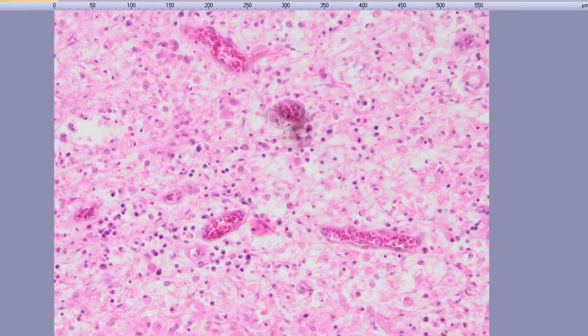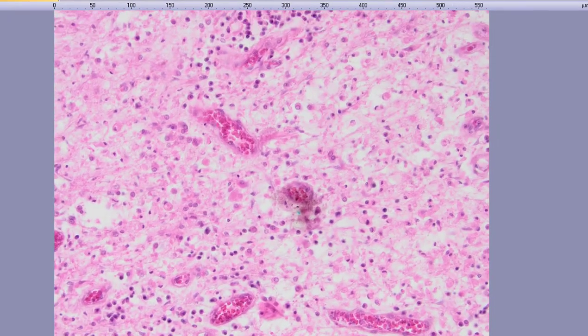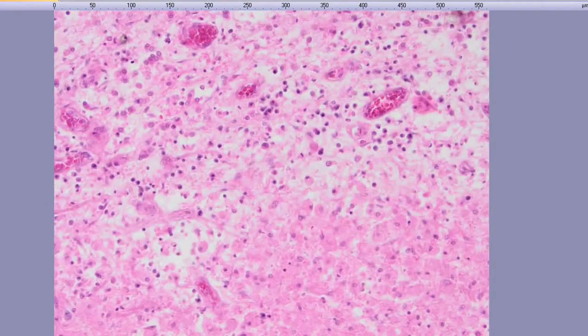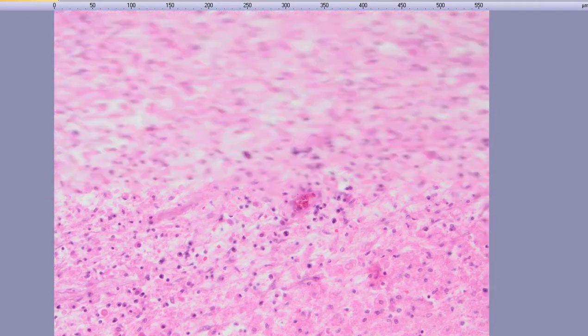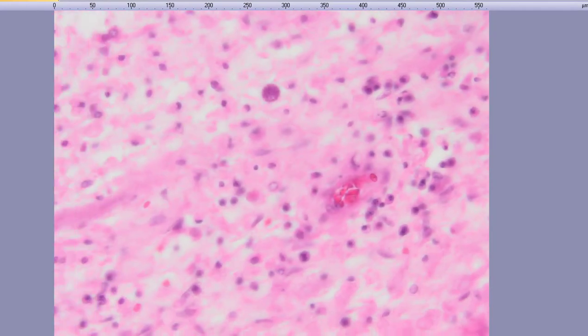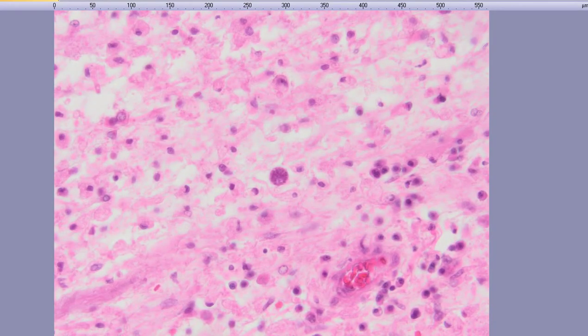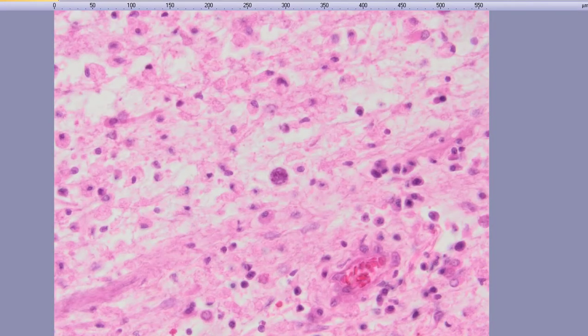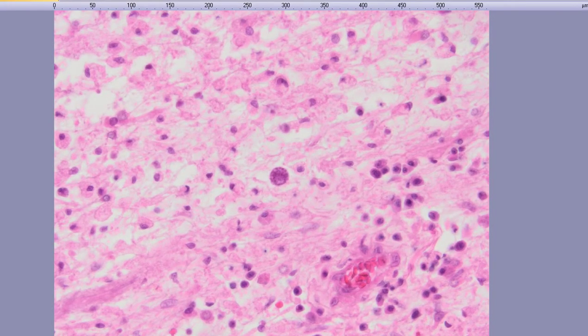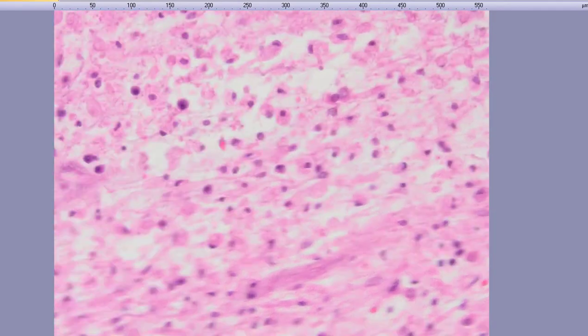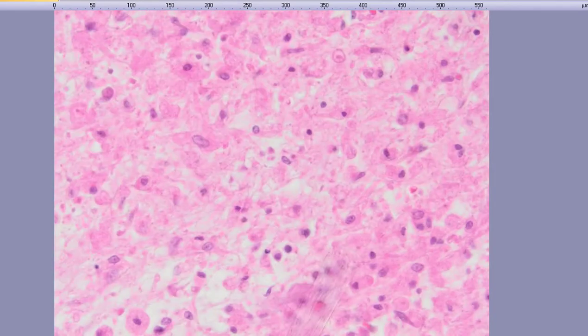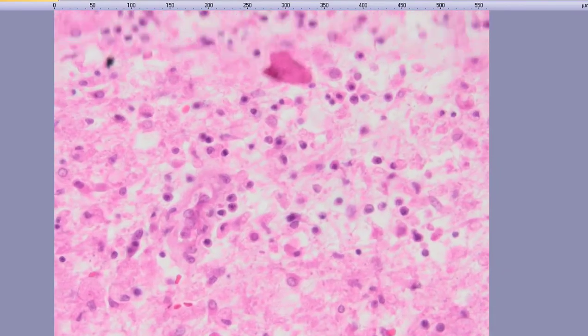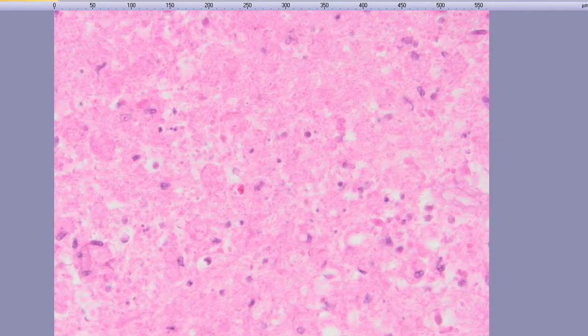Again over here, inflammatory tissue, and then occasionally you start noticing these granular balls. It does raise a suspicion of microorganisms. One is concerned whether there might be microorganisms inside those granules, whether they might maybe be macrophages, but in fact they're not apparently.